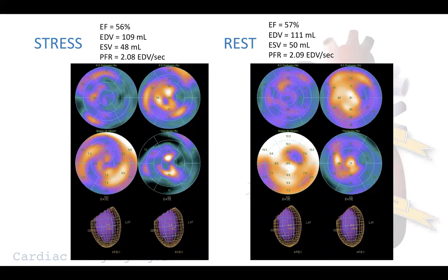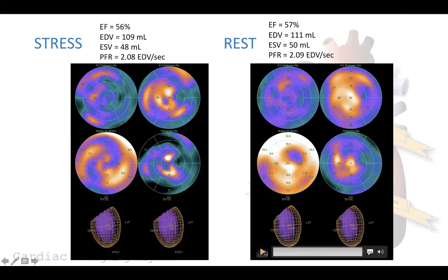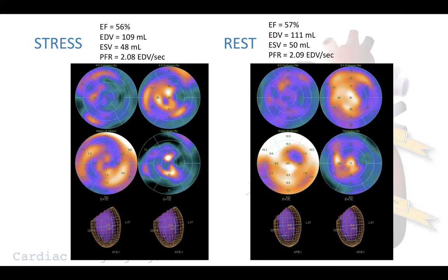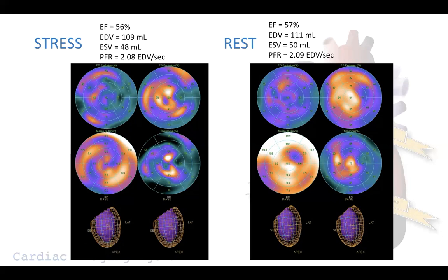And what about the situation in the gated SPECT? In the gated SPECT, we have the possibility to detect the lateral wall — here after stress, 15 minutes from the end of the stress, and here at rest. There is a reduction of the kinesis in the lateral wall after stress, even if the global ejection fraction is quite the same. If you analyze the diastolic function, represented by the peak filling rate — the normal value is around 2.1 — we are in the limbus: not completely normal, but not completely abnormal.